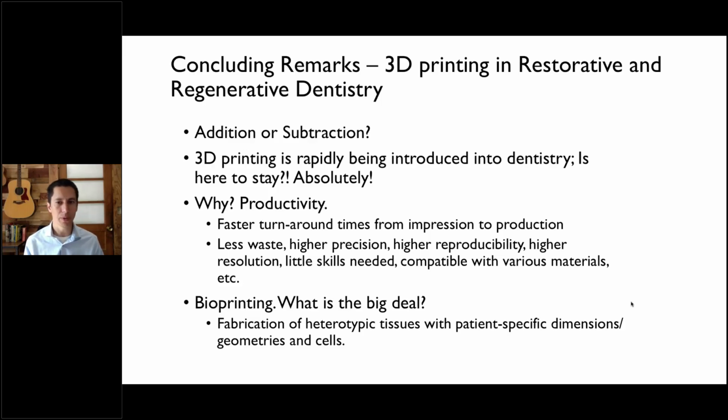3D printing is rapidly being introduced into dentistry, and I think it's absolutely here to stay. The reasons for that go back to the first two slides that I presented: faster turnaround times from impression to production, less waste, higher precision, higher reproducibility. Essentially, I think it all comes down to money. You can get your productivity much higher in a much shorter time with much better precision. As far as the bioprinting goes, what is the big deal about the printing?